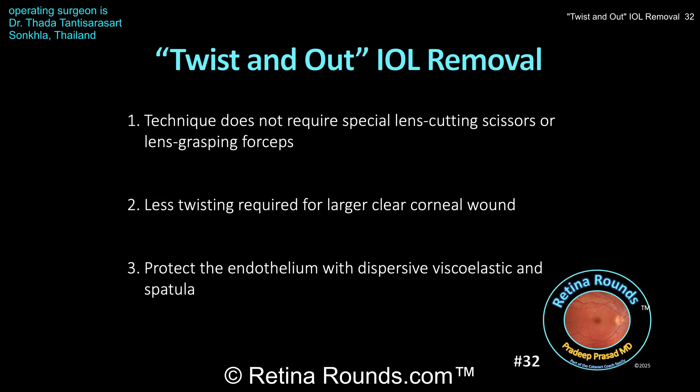You saw in this case that Dr. Thantisarasart enlarged his corneal wound to make this process a little bit easier. The most important part of this entire procedure is to make sure that the endothelium is protected. That's the reason for using a spatula coming across the surface of the lens to prevent the lens, as it's being rolled up, from touching the corneal endothelium. You also want to make sure that you're using dispersive viscoelastic to protect the endothelium. We're going to show you additional techniques for intraocular lens removal in upcoming episodes, but this is a very elegant technique that doesn't require any special instrumentation for lens removal.